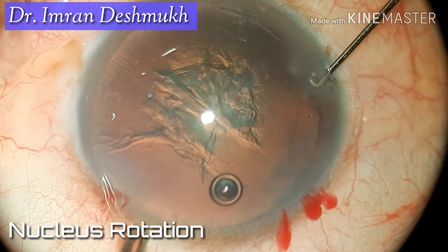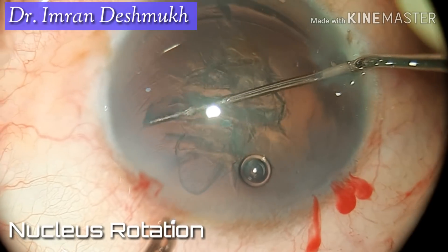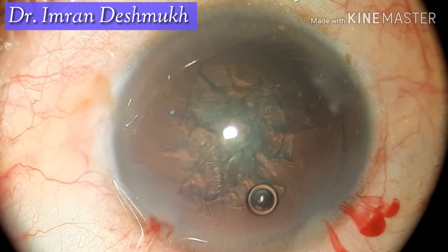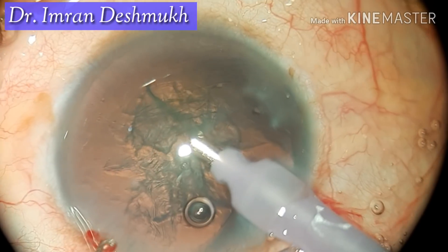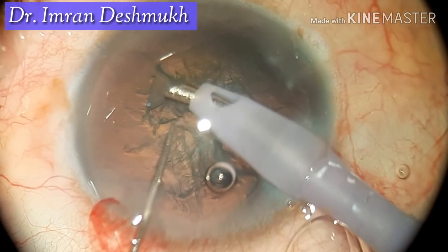Hello everyone. Today we'll be discussing how to deal with a very soft nucleus during phacoemulsification cataract surgery. Once you have done your hydro, slowly rotate the nucleus — as you can see, this is a very soft nucleus, grade 1-2. Once you insert your phaco probe and the sinskey hook, turn your phaco tip upwards.